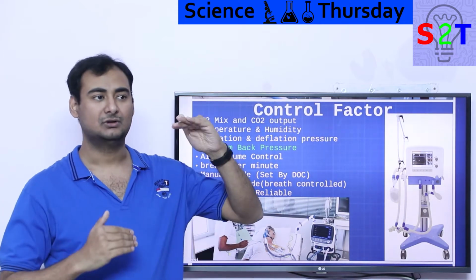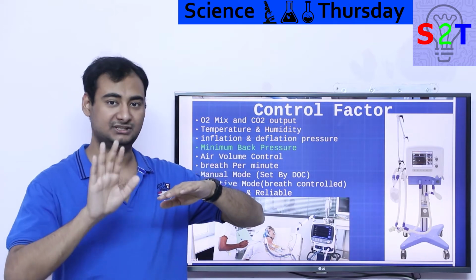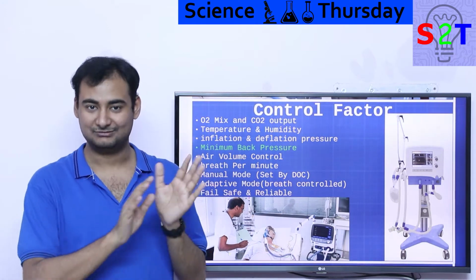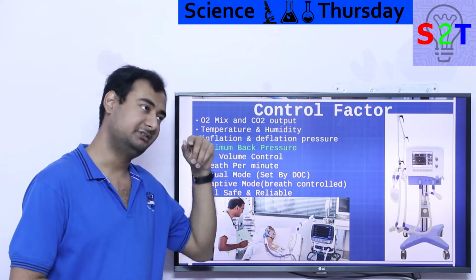Basically, let's say the lungs want to go from 15 psi to 5 psi. You'll be like, no, don't drop to 5 psi. You are in a weak state. If you go to 5 psi, you're going to collapse. You're like, okay, let's stay at 10 psi. Now again, ask a doctor. These numbers are just a reference idea, but that is very critical, and it is different for every person.